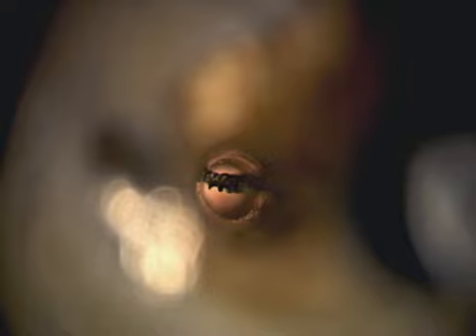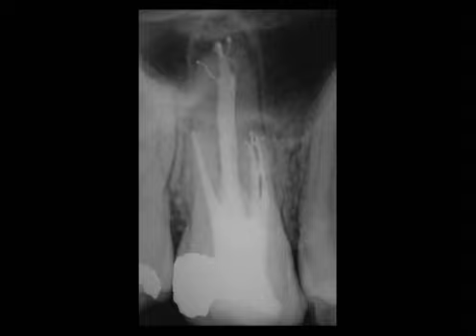A photograph at high power provides a deep look into the apical 1/3 of the palatal canal and reveals sealer entering into the lateral canal that I missed. Another photograph at high power also demonstrates that the micro-opener's working end has entered into this lateral branch. The working film demonstrates the 10 file moving through this ramification to its terminus. It was exciting to see the post-treatment radiograph, which revealed that we had addressed the root canal system anatomy. This should set the stage for long-term predictable success.